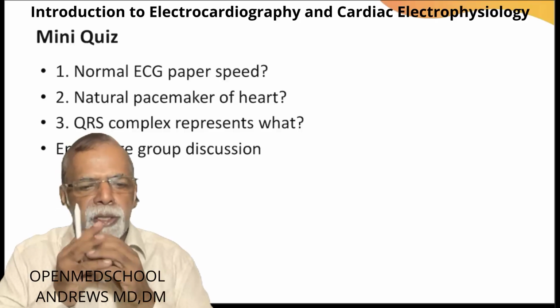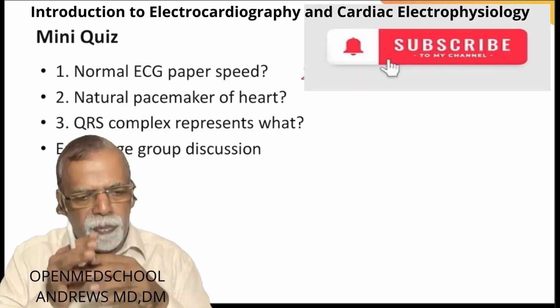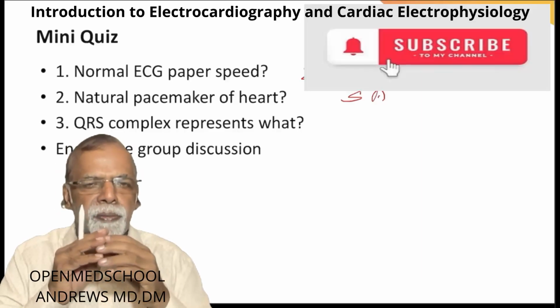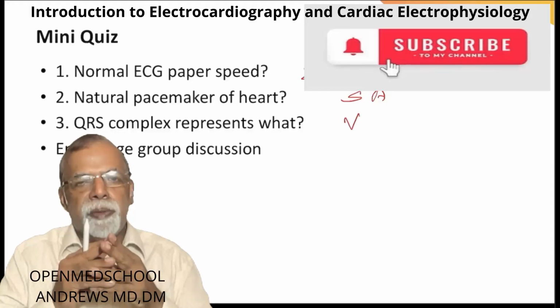So take home message: ECG records electrical activity of the heart. SA node is the natural pacemaker. You should always check the calibration. Systematic interpretation is essential. ECG is indispensable.